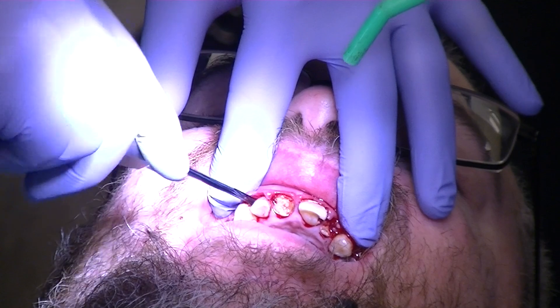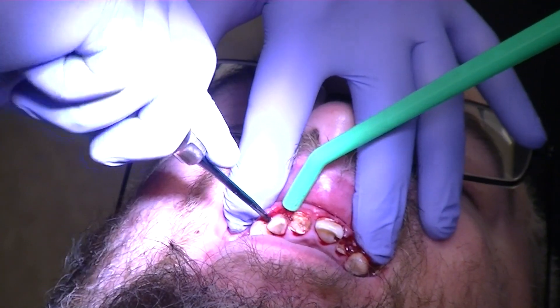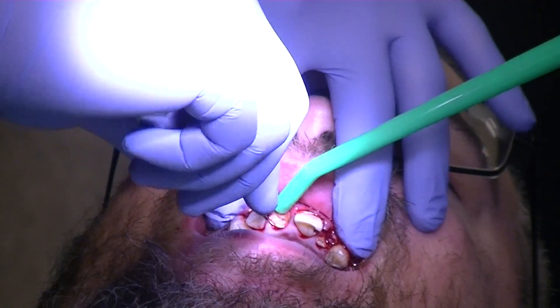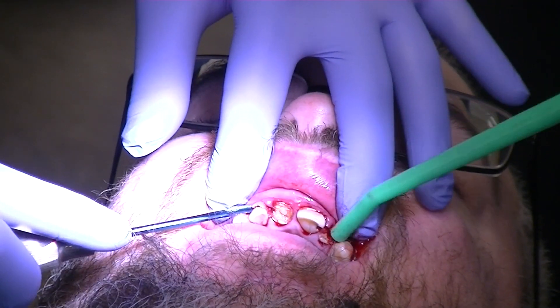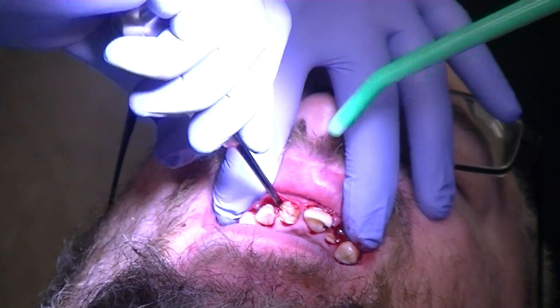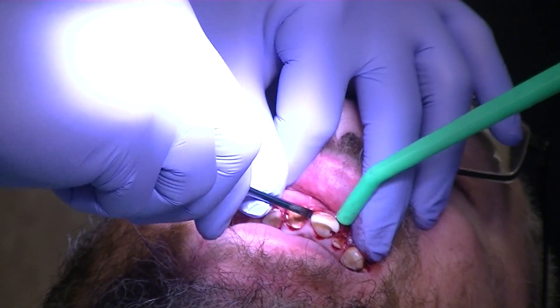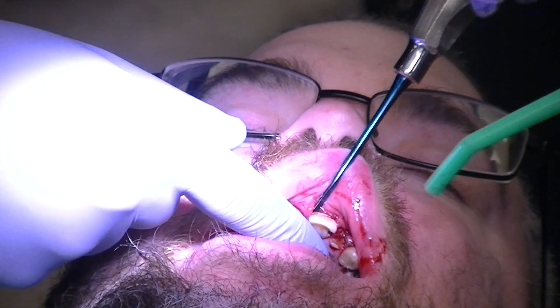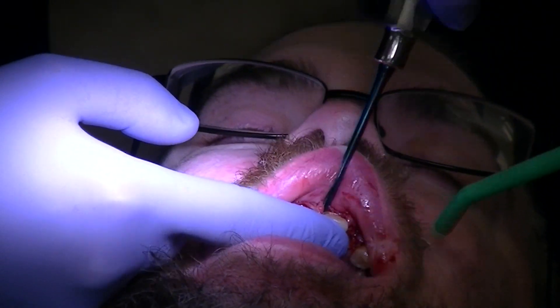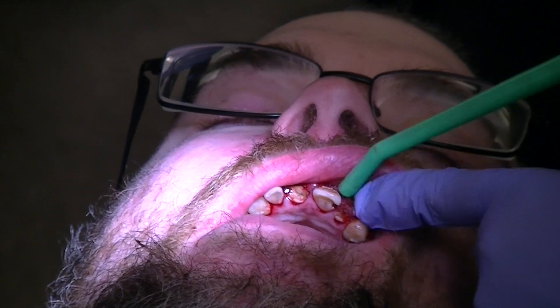We're going to do the same thing here with the lateral. You can see the composite breaking off right on his tongue. Now when we put the physics forcep on there and it just keeps going through all that decay, what would you suggest? Correct — make a C on the lingual.